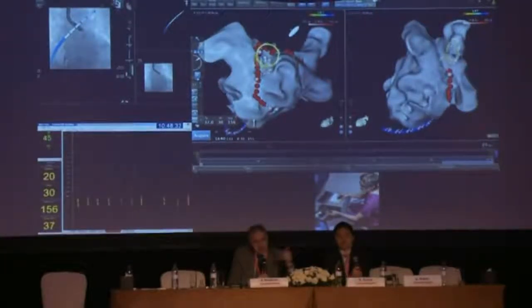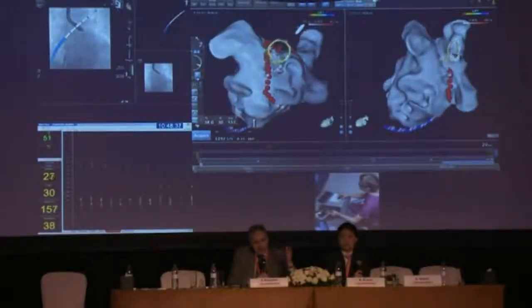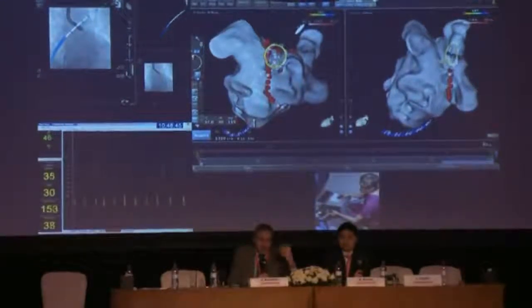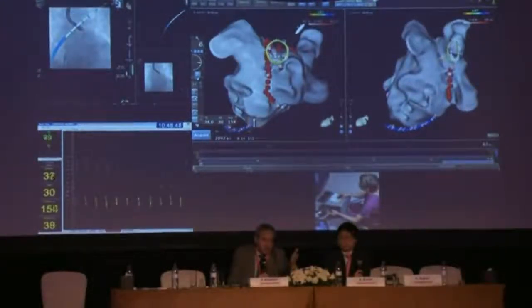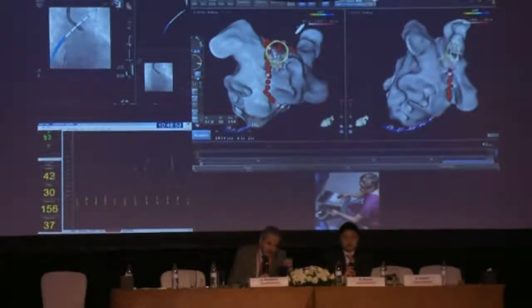So we've already talked about the obvious differences, i.e. if you do it repeatedly, you know in the back of the lab, exactly where the ridge is. You can use alternatively also intracardiac echo to see exactly where you are. With what we use in our setup, but Smart Touch is very good because it tells you really that you are pressing to carina from that side or from that side.